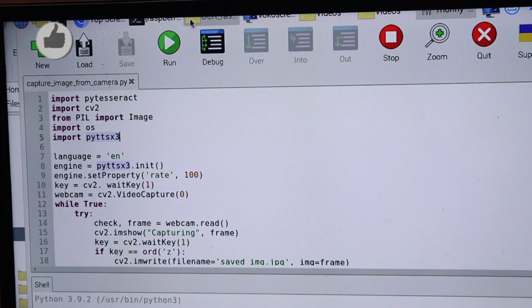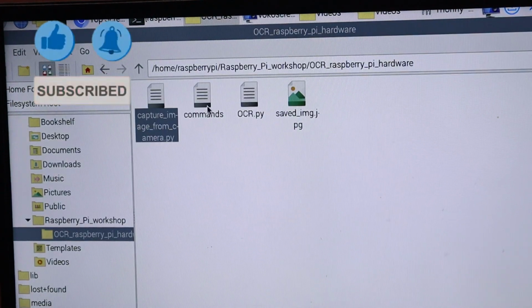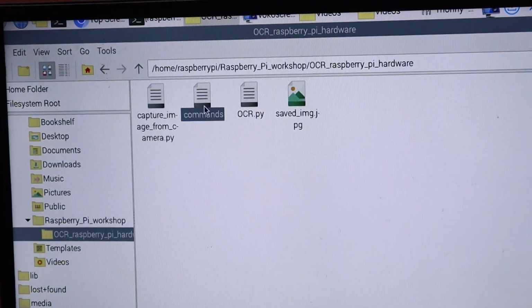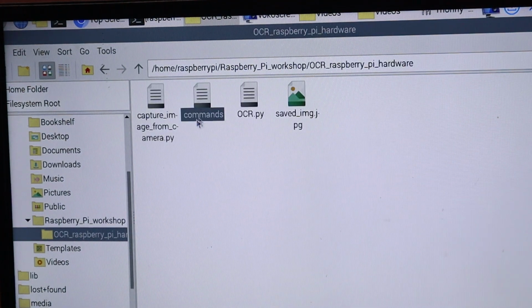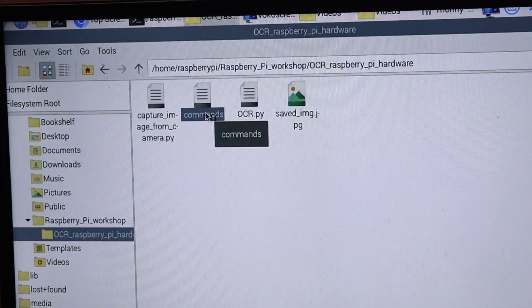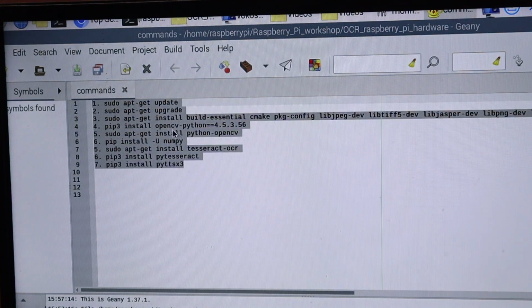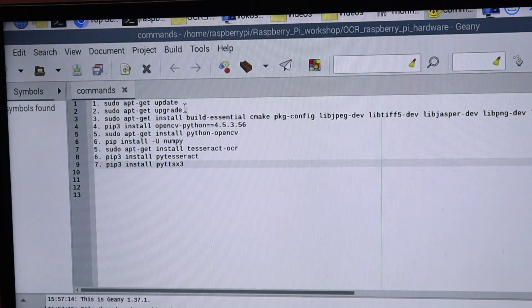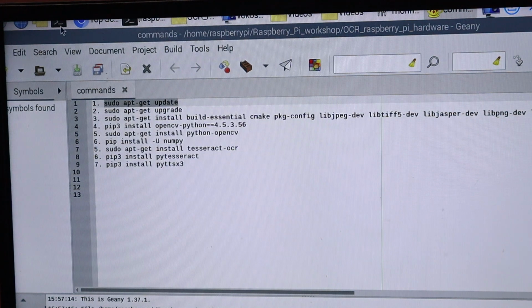Once you install the latest OS on the Raspberry Pi, the second part is you have to execute all these commands on the Raspberry Pi. So how to execute all these commands? In the same folder, you can see there is one command list. Double click on this list, and you can see all the commands given here. You have to copy them one by one. Let's say first I copy this command, and then go to the terminal.